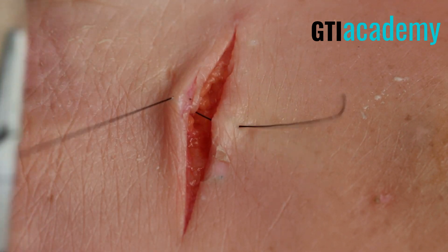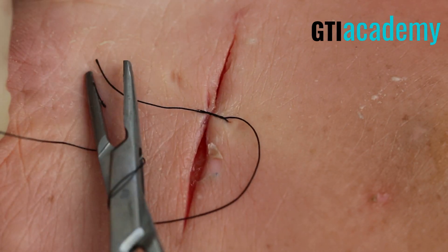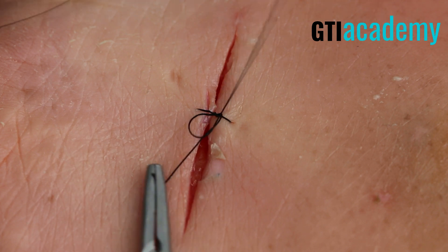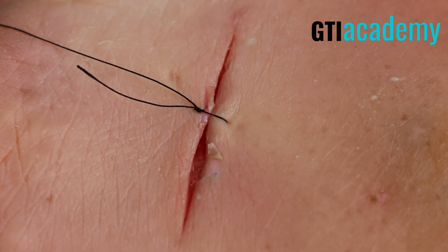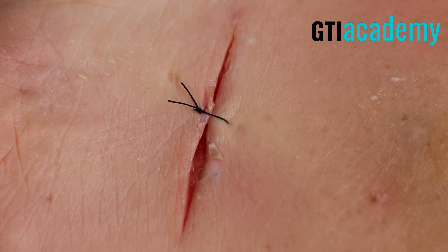Now I'm going to lay a surgeon's knot. Simply wrap the suture twice around the needle driver and complete. See how flat this is? And then once and a second — wrap the suture around once around the needle driver — and I'm going to pull this suture knot to the left.